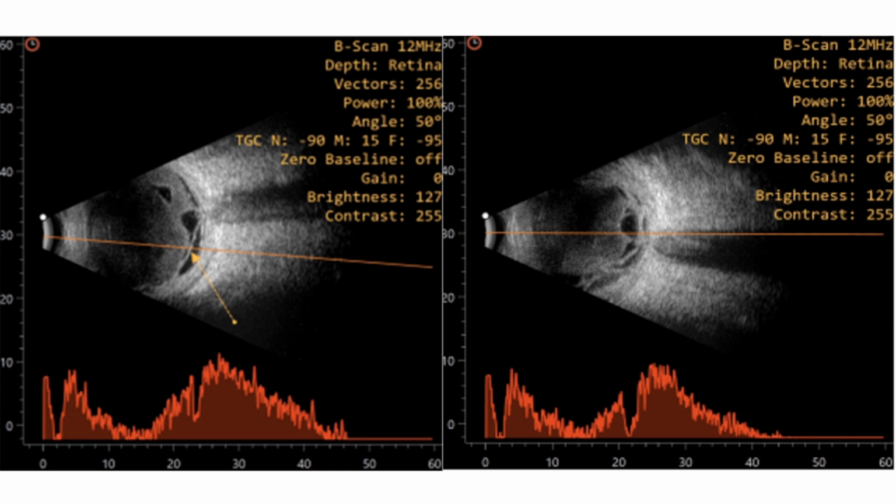What other sign can you see in this ultrasound? Mild subtenon space widening is also noted here. This one, the next one, and even the previous scans also are showing it. Yes, ma'am. So what is the reason for that? What would you suspect if previously it was not there and now it is there?